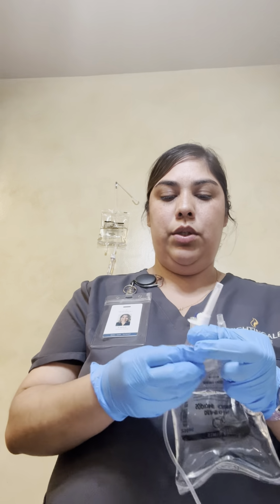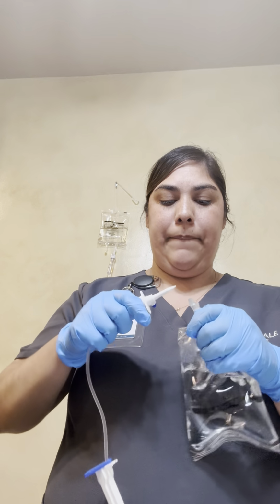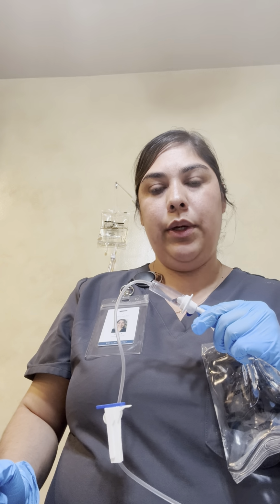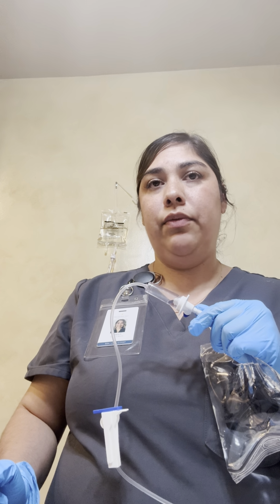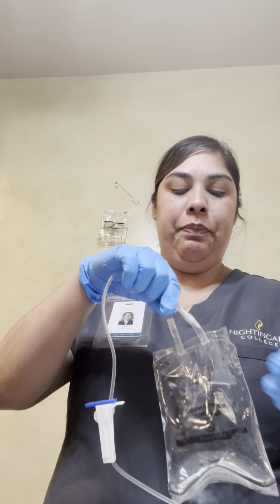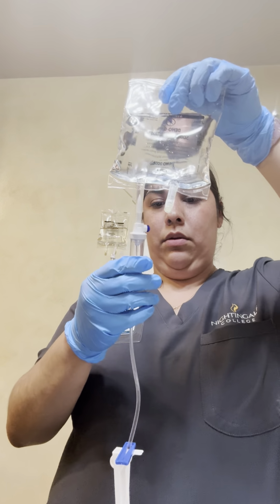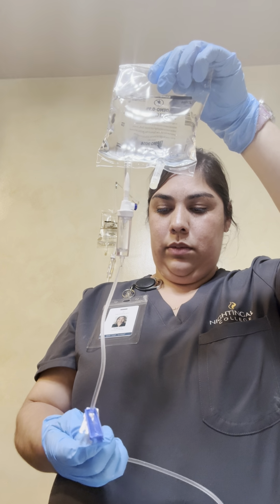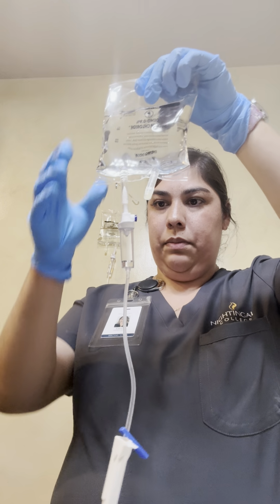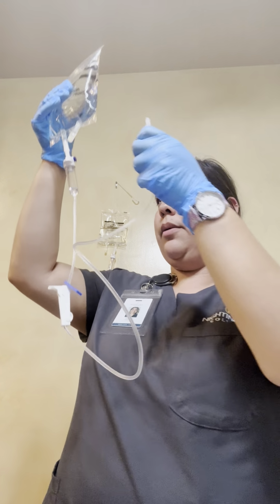Again, you do not want to do anything. Before we connect our patient, we always want to look at the IV site to make sure that it's okay. No redness, no infiltration, no swelling, no bruising, that it's intact before we ever hook them up, which we did. That's already getting loose. Oh, it's already going. I should have made sure that was clamped beforehand. That's why we always double check.